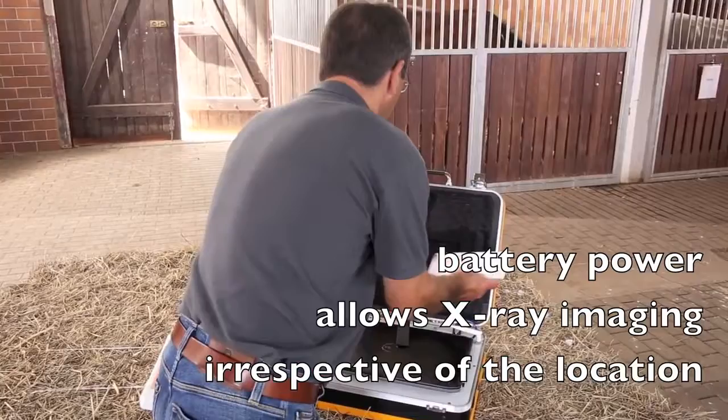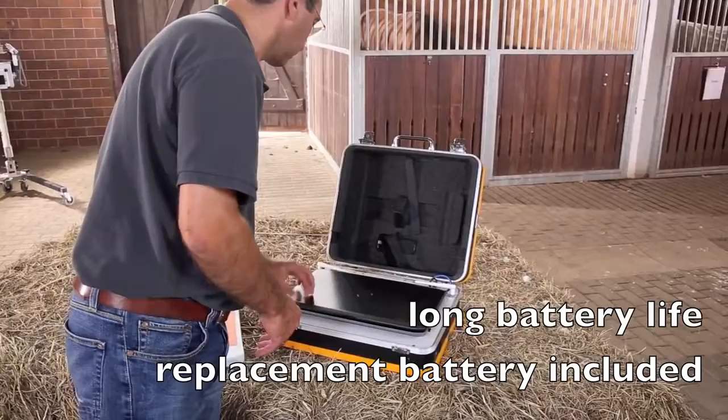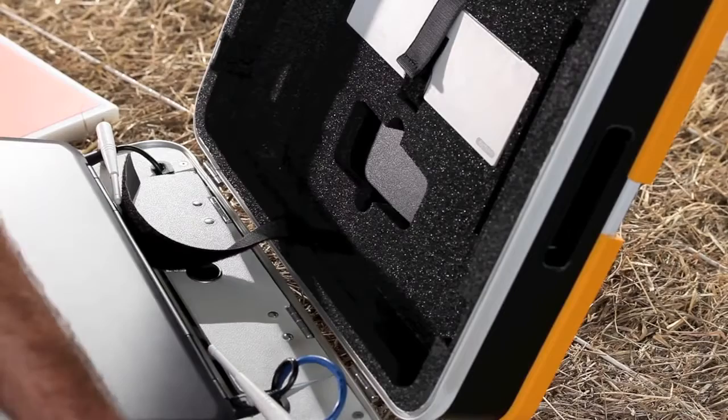Battery operation ensures that no electric power supply is required. The detector battery allows up to 4 hours of work. An additional battery included in the suitcase doubles the operation time.